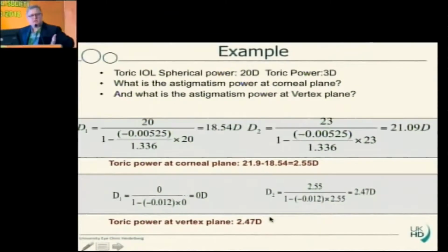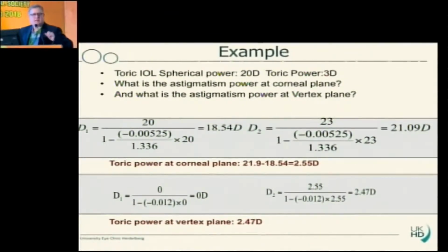It is not such a big problem in routine, but this combined with, for example, the posterior corneal astigmatism can give us a little bit of pain in the low astigmatic corrections. If we are talking about 1 or 1.5 diopters, and afterwards we're wondering why the patient still has 0.75, this derives from all these little factors together.